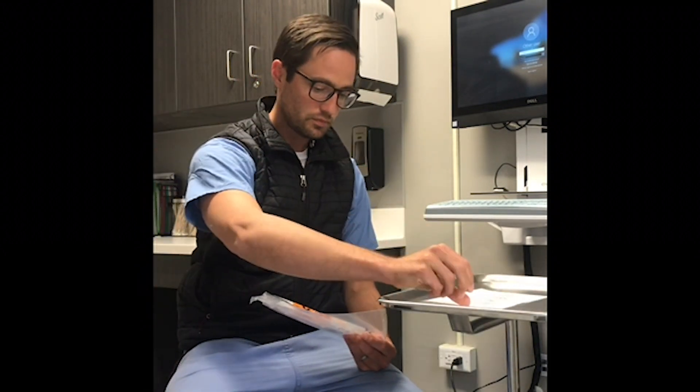When you check in at self-swabbing, you'll receive your packet. Inside your packet will be written instructions along with the actual swab kit.